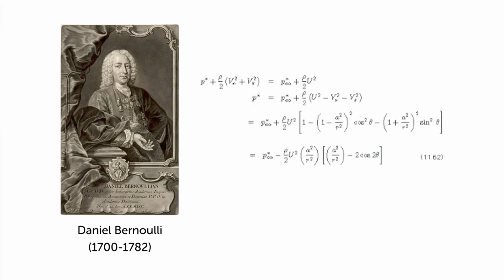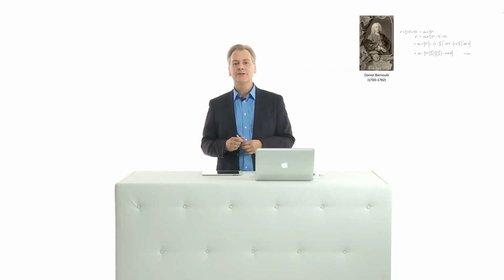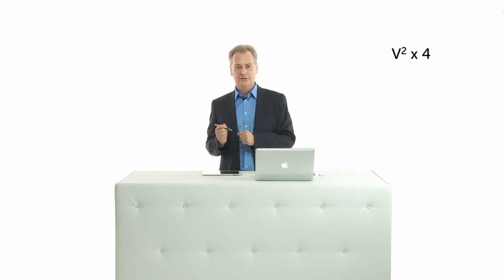Now, this still doesn't tell us how we can get to the degree of aortic stenosis. To understand that, we first have to use an equation which was created by Bernoulli, the so-called Bernoulli equation, to tell us what the relationship between the velocity and the degree of stenosis is. Now, you will not have to remember this equation, of course. We use a very simplified version of it, which simply is velocity squared times 4, which gives you the gradient between the stenosis before and after the stenosis.